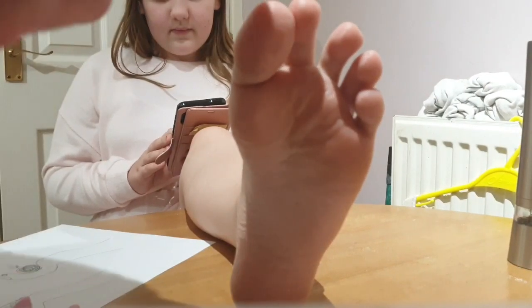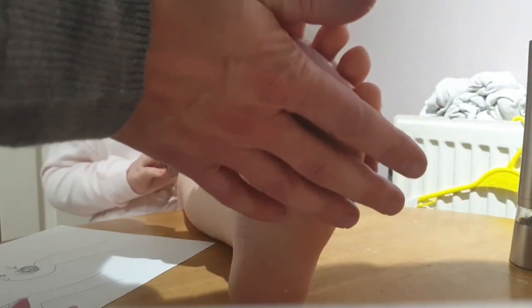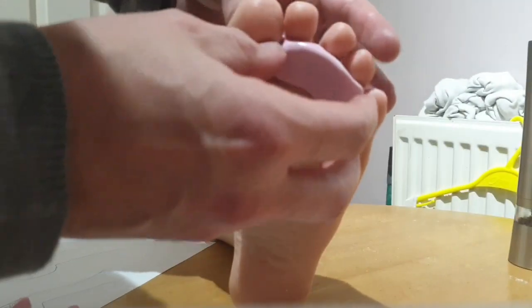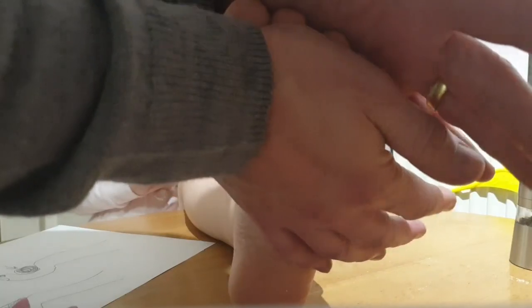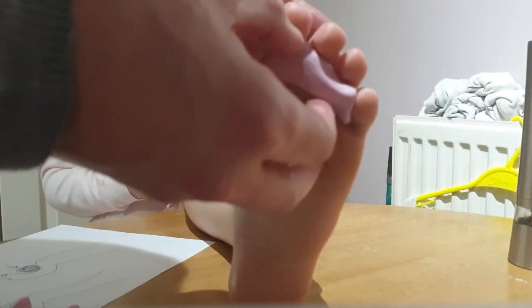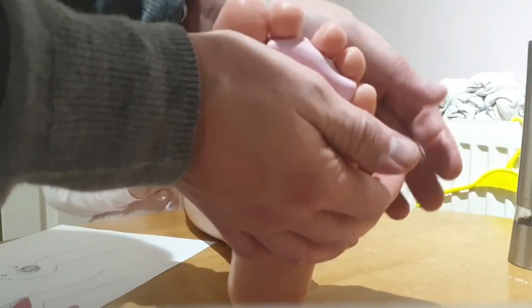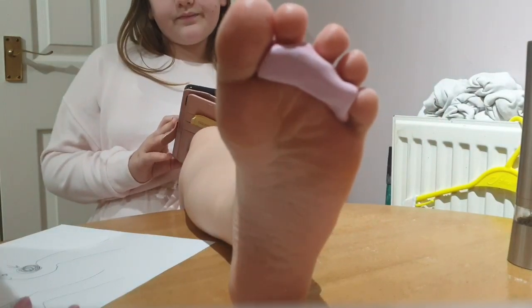For a triple toe prop — similar to the handbag design — pop one end in there, flatten it, poke it through, flatten it at the top on the other end. Toes want to be together enough that it doesn't push these two apart, and always push it away from the plantar fatty padding — that's the most common area of irritation if you don't. Don't push it too hard down either, or it won't actually lift the toes. If you imagine those toes were overhanging, this will also stop the little toe from burrowing underneath the fourth toe.